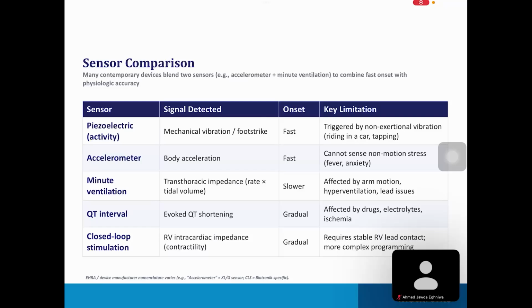This feature will sense the sudden drop, calculated by drop size on heart rate, and it will pace for 1 or 2 minutes at a high heart rate. All these parameters are adjustable.